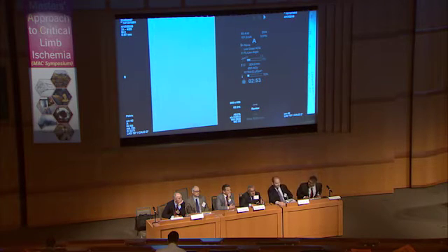I'm concerned because here there is a three-vessel disease. There is no direct flow into the tibial, so the outflow from the SFA should be compromised. So we have to treat, or we decide to treat, at least two vessels in the leg to give an outflow to this implantation. Or we have to avoid deploying a long Viabahn.